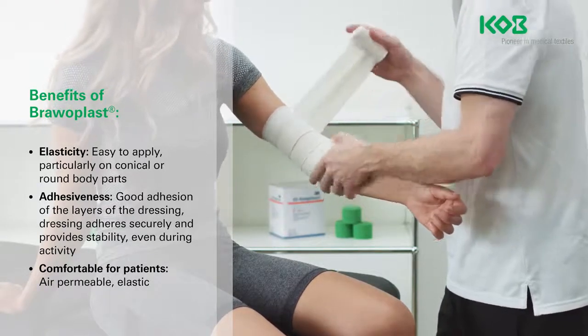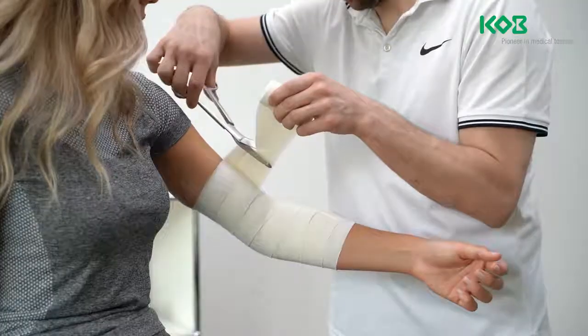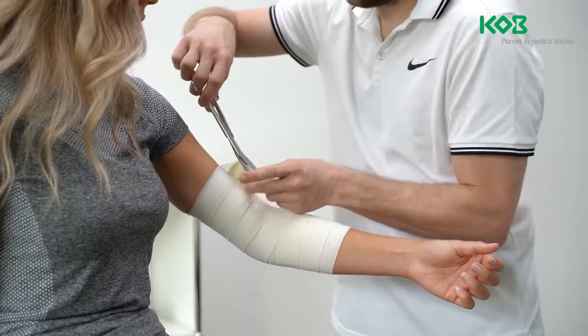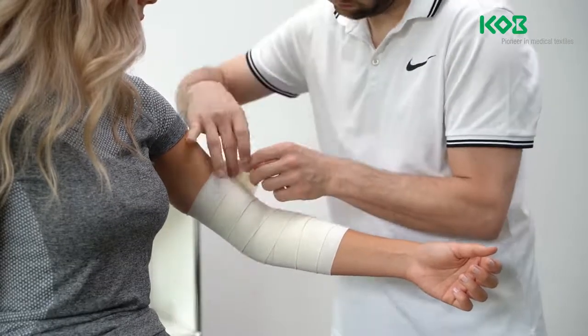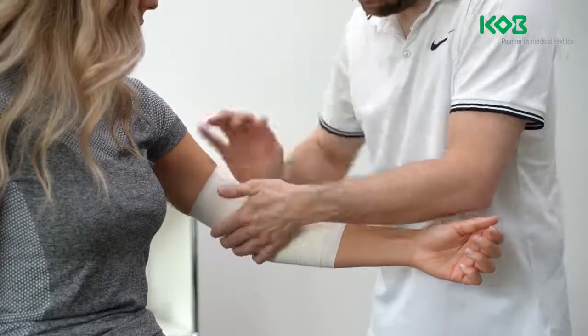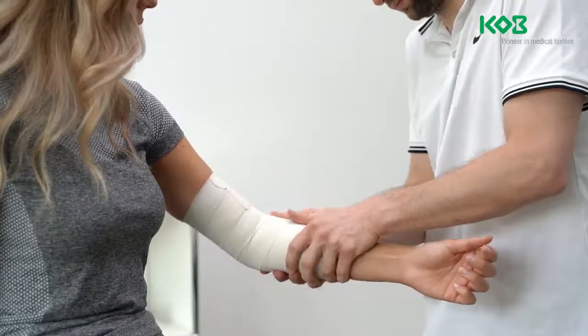At the appropriate point, cut the bandage and press the end of the bandage and the entire dressing on with your hands. The ends of the bandage do not need to be fixed. The dressing should fit well, but not be too tight and have as few wrinkles as possible.